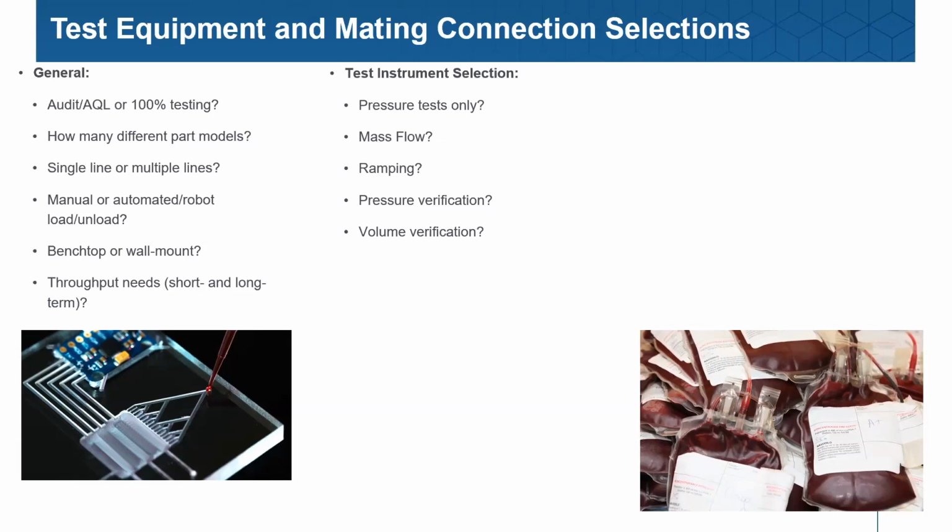Now let's flip that. Maybe we're testing a part that's sealed. The only way to test a part that's sealed is you have to put that into a chamber, typically vacuum chamber. We'll do a volumetric verification to make sure that we don't have a gross leak. Imagine taking maybe a foil sealed pouch or a sachet that you may be using in the packaging area of your company for some devices. Imagine putting that into a vacuum chamber. Now, normally we're going to simply apply vacuum and try to suck the air headspace out of that foil sealed pack. And that's very straightforward. No rocket science there. Easy.